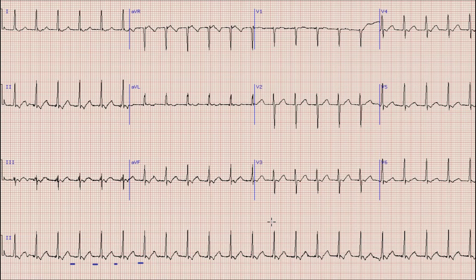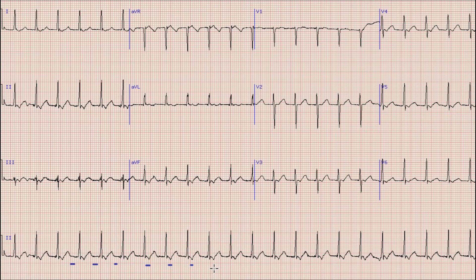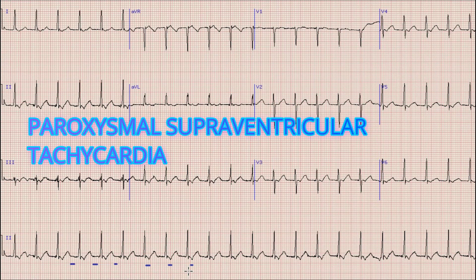The next differential is atrial flutter with fixed AV block. For atrial flutter, there should be P waves at a rate of around 200 to 400 beats per minute. Searching for P waves, we can see that after each QRS complex there are negative deflections — retrograde P waves representing atrial activity. However, the rate of these retrograde P waves is around 150 per minute with one-to-one conduction, so atrial flutter is less likely.